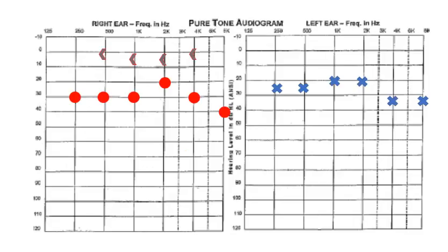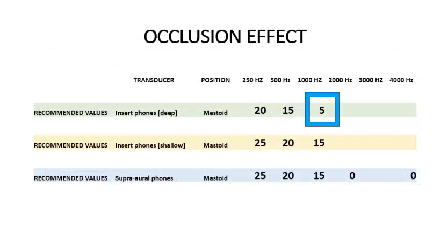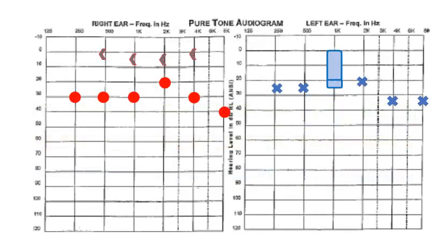The first item is the hearing threshold of our non-test ear. We need to compensate for this situation. In this case, it's 20 dB. So the first part in constructing our initial masking level is a 20 dB value. We often need to compensate for the occlusion effect during bone conduction measurements. We're using insert earphones, and our test signal is 1000 Hertz, so the occlusion effect compensation here will be 5 dB. We'll include that level into our IML construction.